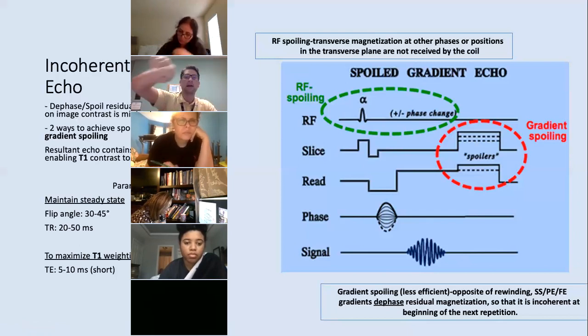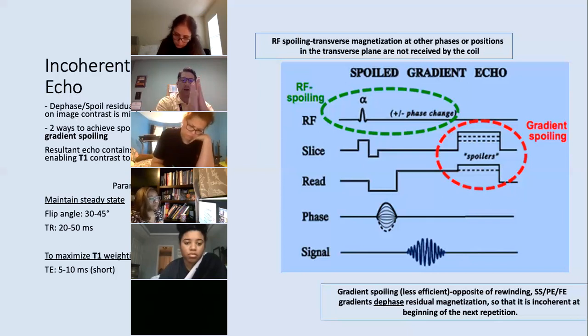That vector kind of continuously rotates around B sub 0 in the transverse plane. So if we start a pulse sequence, say at 12 o'clock, the next TR, we might set it at 1 o'clock. And that is designed so that the free induction decay and the stimulated echo don't overlap each other because they're off phase angle just a little bit. So that's what RF spoiling means.